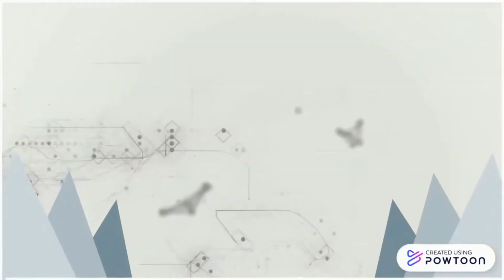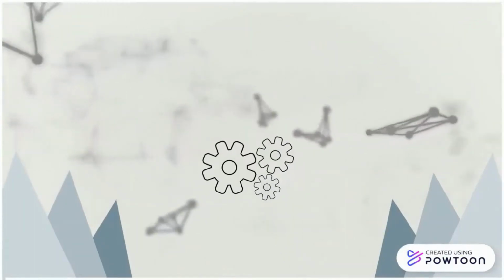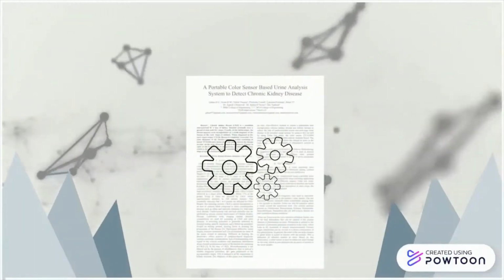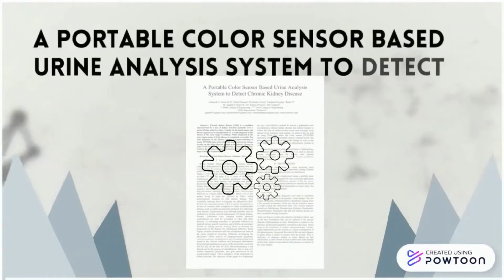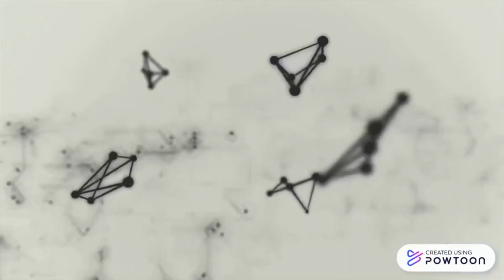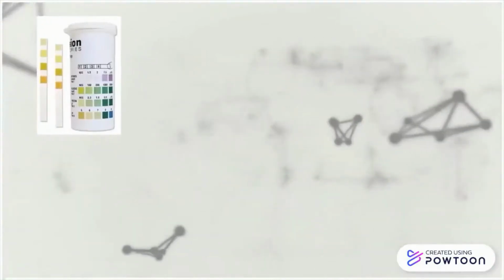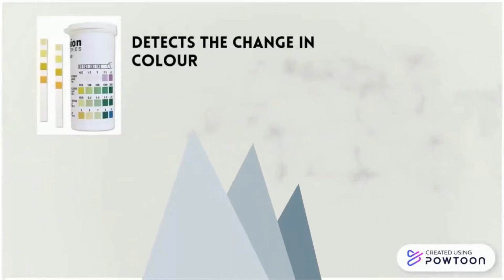In conjunction with our case study, I have found an article which gives a justification for a smart sensor used to detect kidney disease: a portable color sensor based urine analysis system to detect chronic kidney disease. This system provides an early diagnosis of the disease. The sensor detects the change in color on the strip of urine sample.